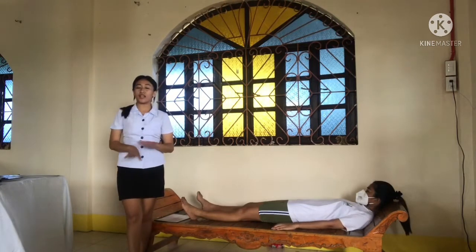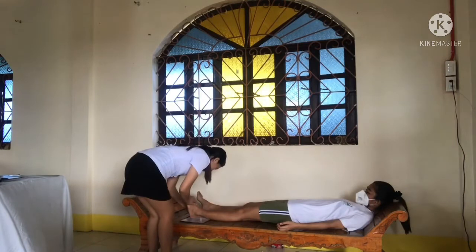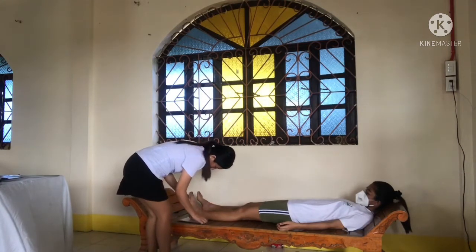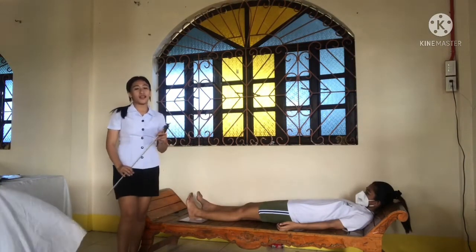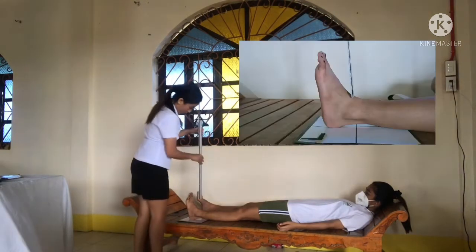Position to obtain a true AP projection. So, flex the ankle and foot enough to place the long axis of the foot in a vertical position. So, the central ray for this projection must be perpendicular through the ankle joint at a point midway between the malleoli.